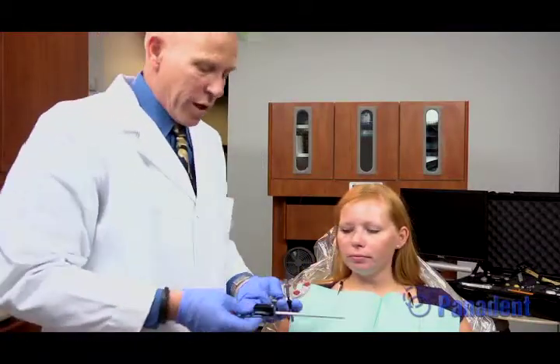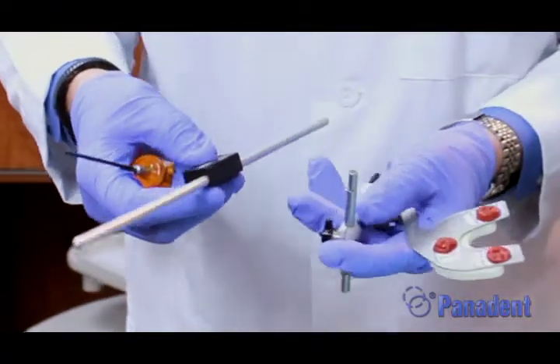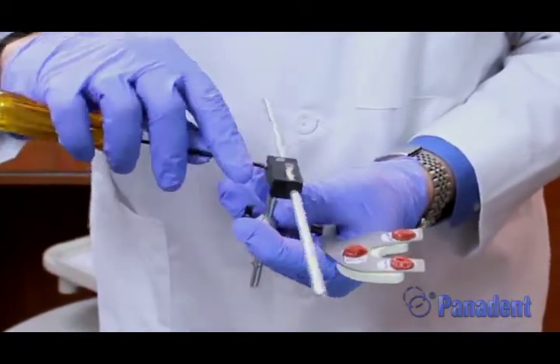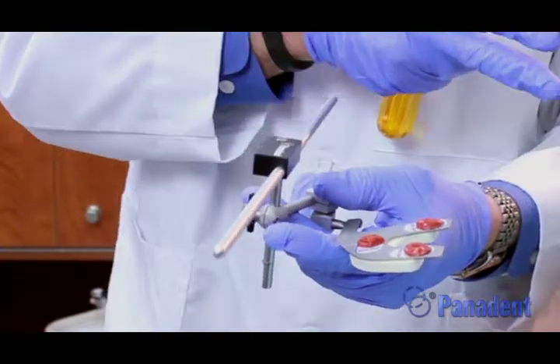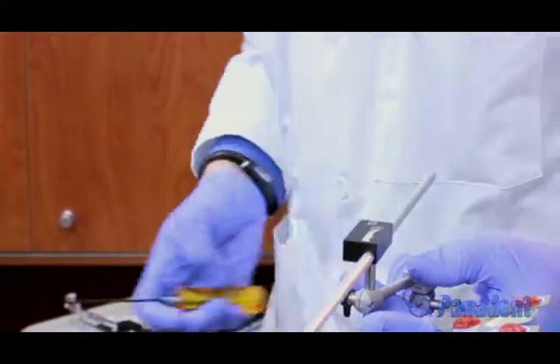For the true hinge axis transfer, we have what's called the crossbar and clamp. The crossbar and clamp is going to go over the top of the bite fork stem assembly. The flat is going to go towards the screw so we can tighten that up. That now simulates the crossbar from the recorder, so we can now add our recording arms back on here to go back to the true hinge axis marks we marked on the skin.